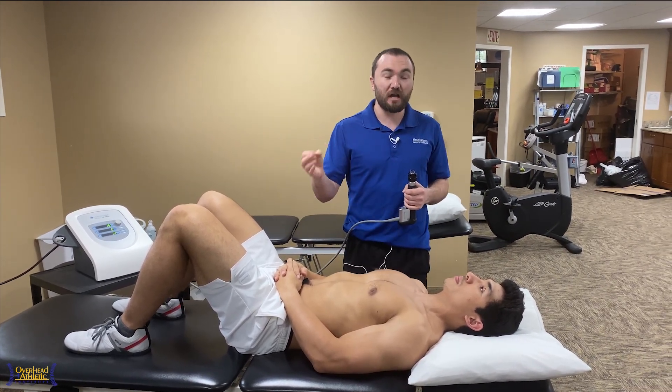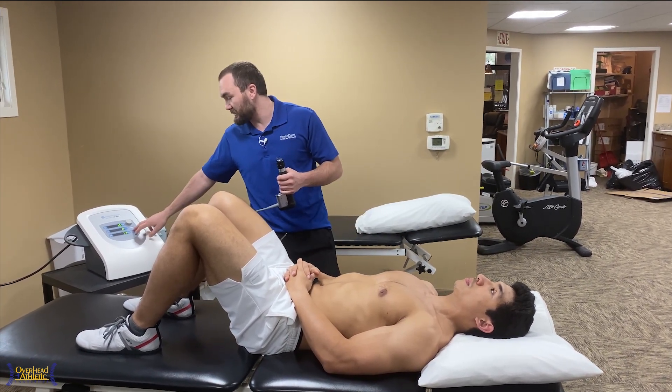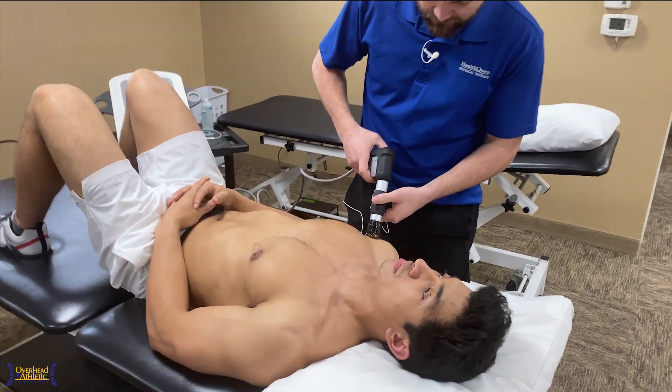Extracorporeal shockwave therapy is something that we can do to capsular tissue, muscular tissue, and in this case we're dealing with the capsule. We're going to go up to about two bar and deliver the shockwaves at 15 hertz.